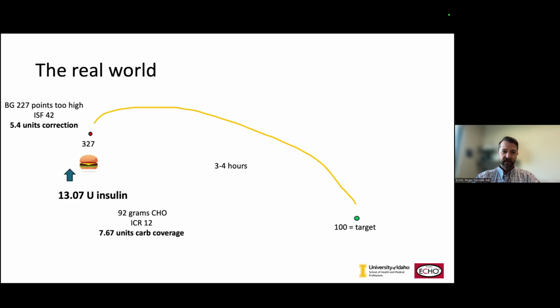And until about 7, 8, maybe 10 years ago, I used to really think of insulin pumps as glorified calculators that delivered insulin, because they essentially did all of the math, because this is difficult math, and it was just a huge burden for patients to do this.